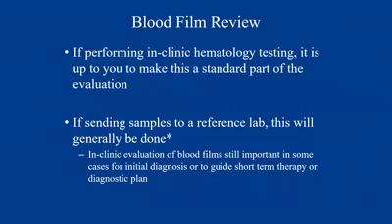So if you're doing in-clinic hematology, if you're doing your own in-house CBCs, it is up to you to make this a standard part of evaluation. I am a fan of doing a blood film review for every patient every time, which we have the luxury of being able to do here at the university because we have a small army of medical technologists. But it is really important out in general practice. And I understand, I was in general practice for a few years before I went back and did my residency. And so I know that we all get busy, but it is really important to look at this stuff.